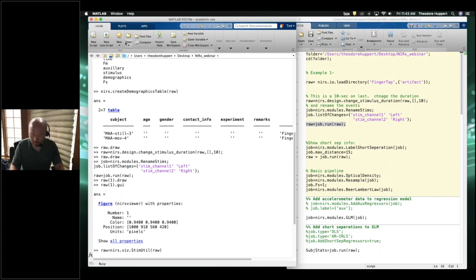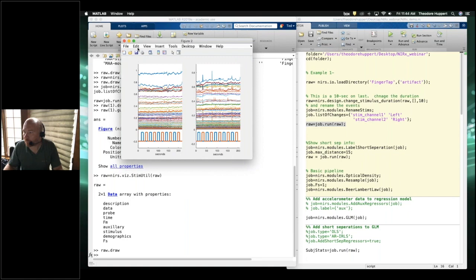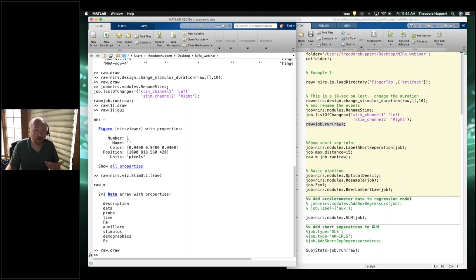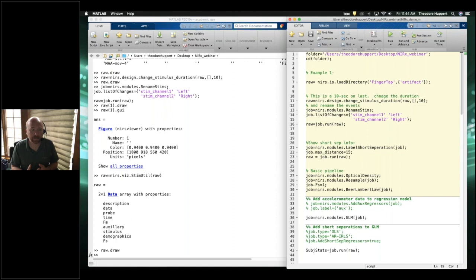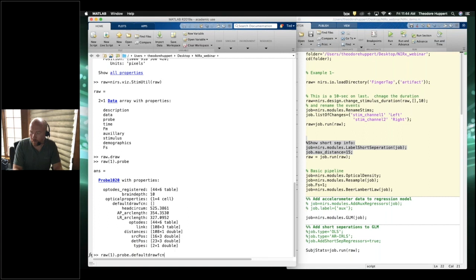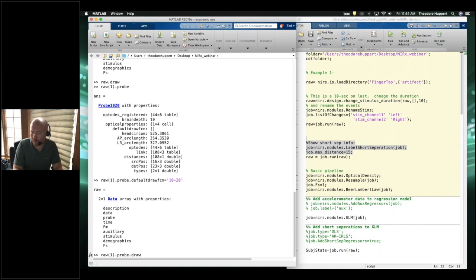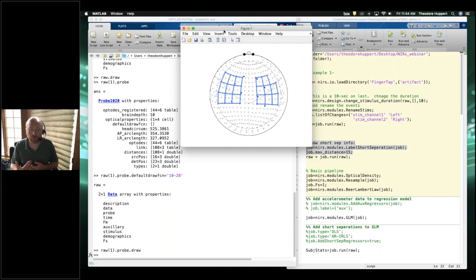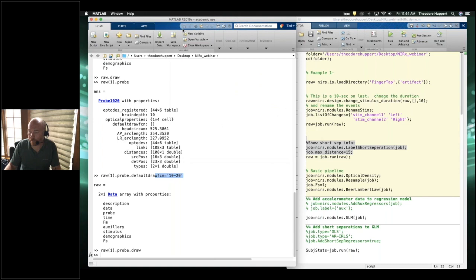So that's just prepping the data — we now have these two files with timing labeled and so on. If we look at raw.probe, we can change the default draw function. Before it was drawn as a 2D plot. I changed the default draw function to '10-20' so now when we draw it, it draws in 10-20 space.